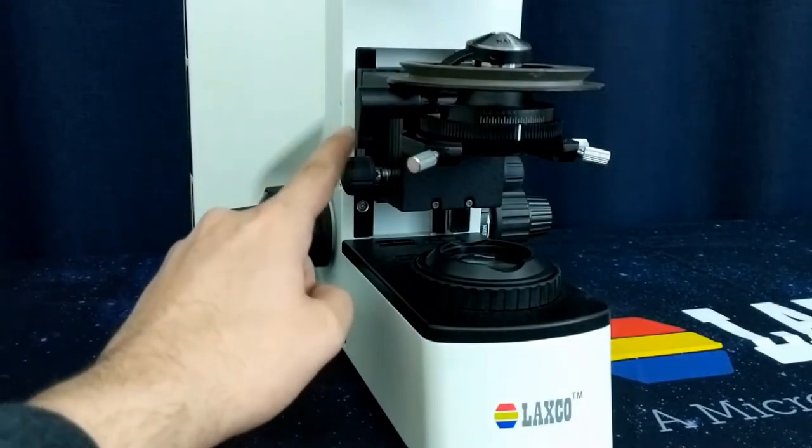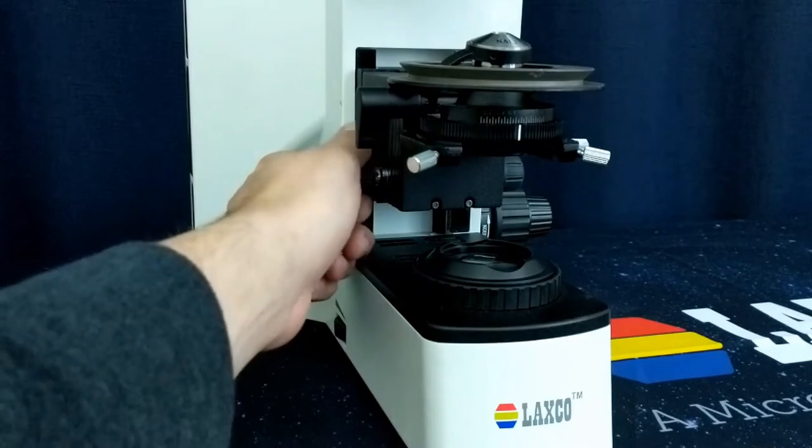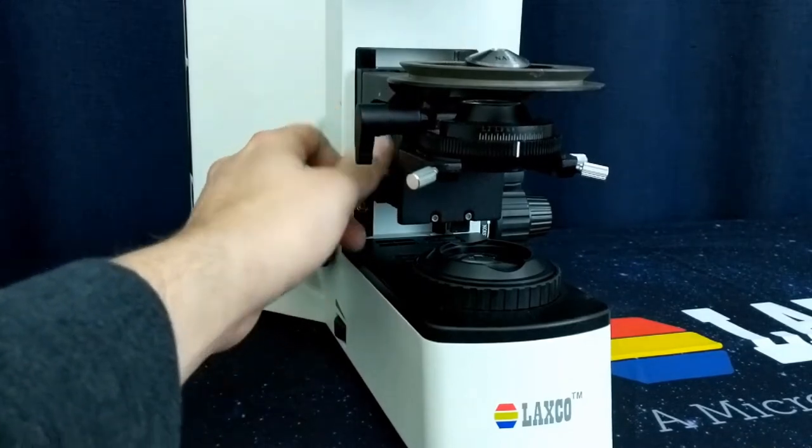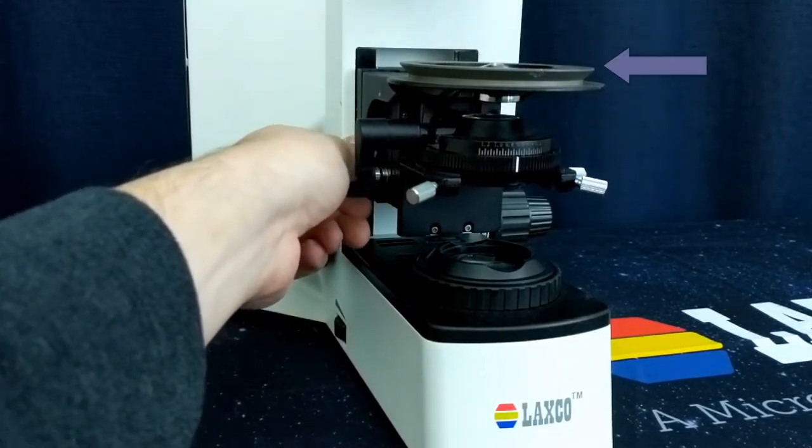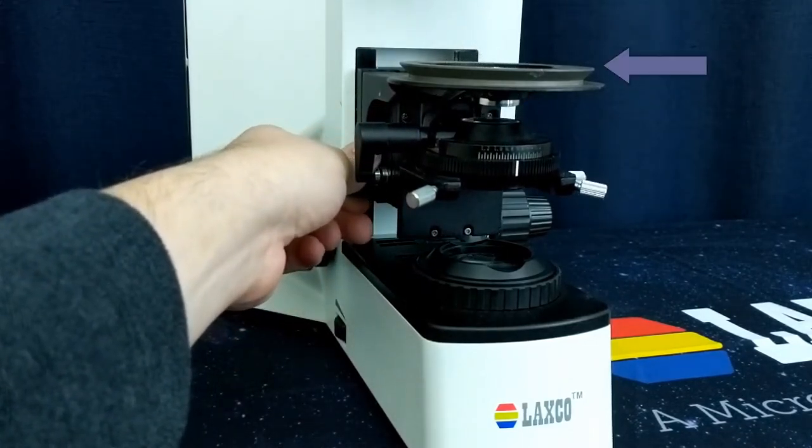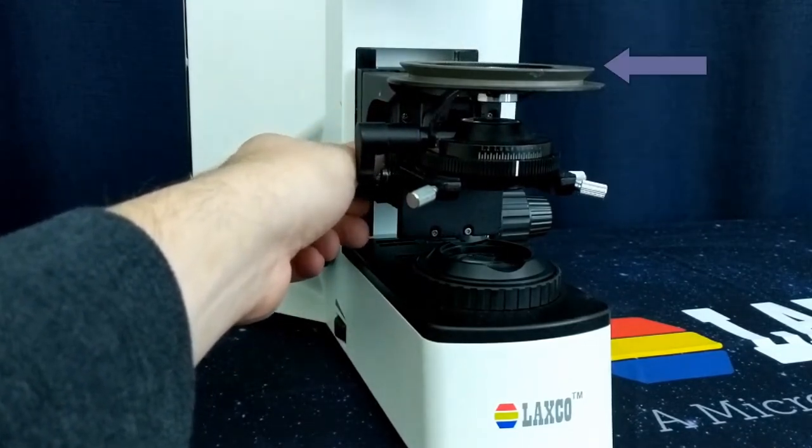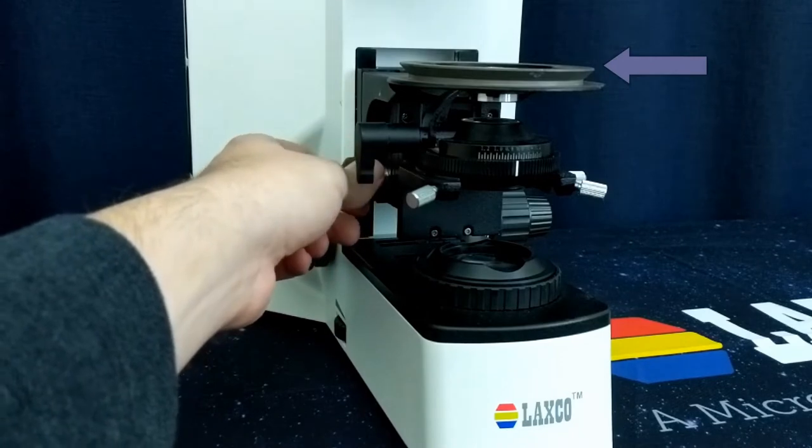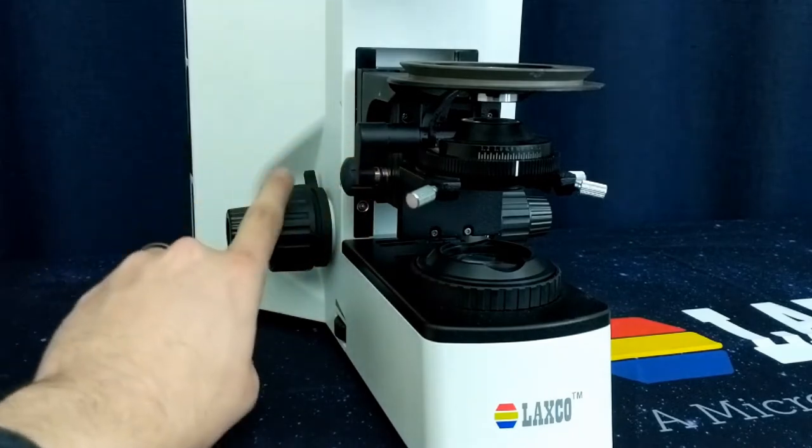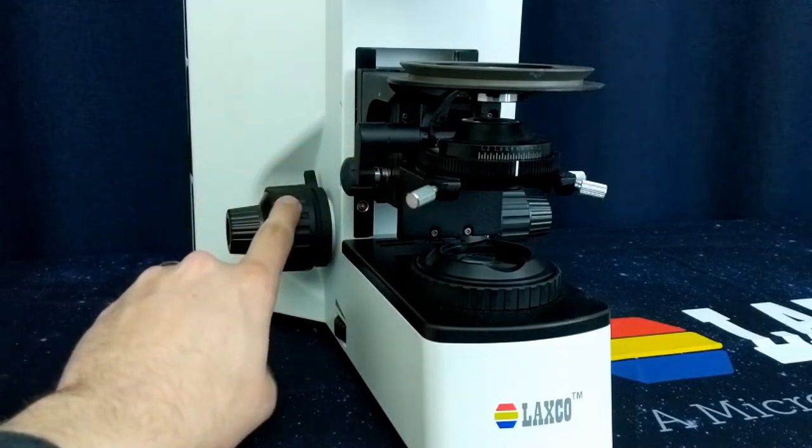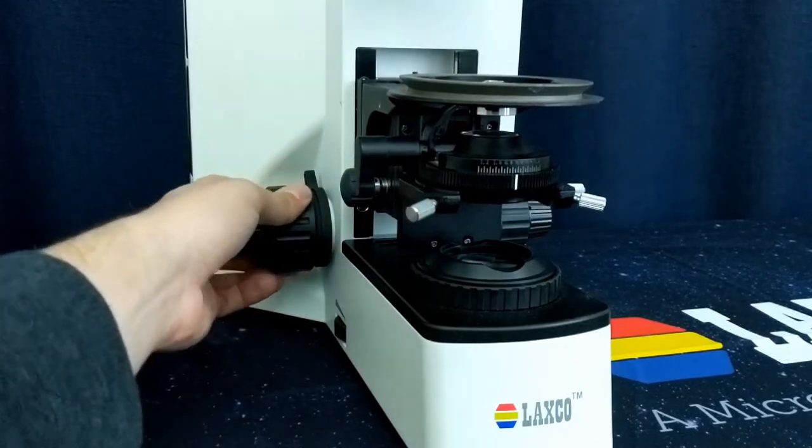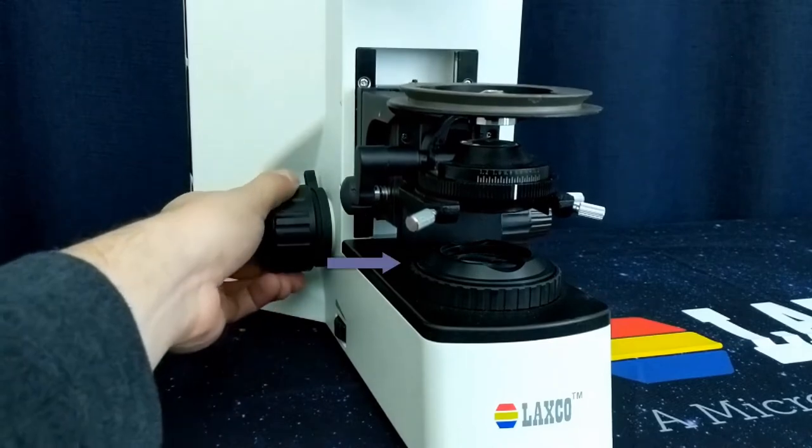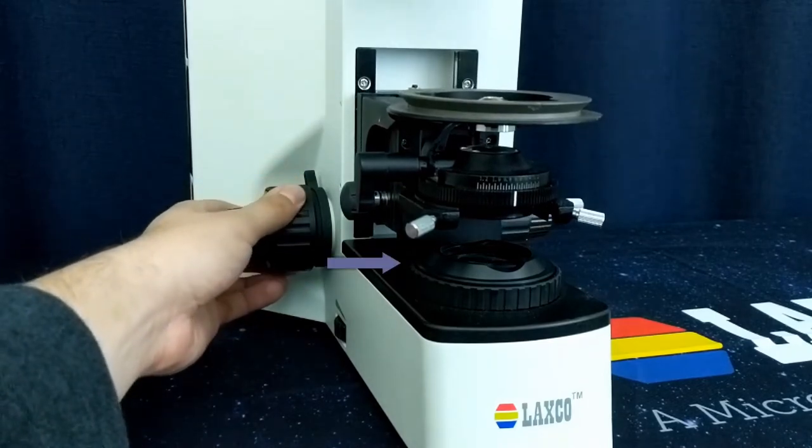Using the condenser height adjuster, lower the condenser until the flip out lens is level with the stage mount. Using the focusing knobs, lower the entire assembly until it is as low as it will go and touches the base of the microscope.